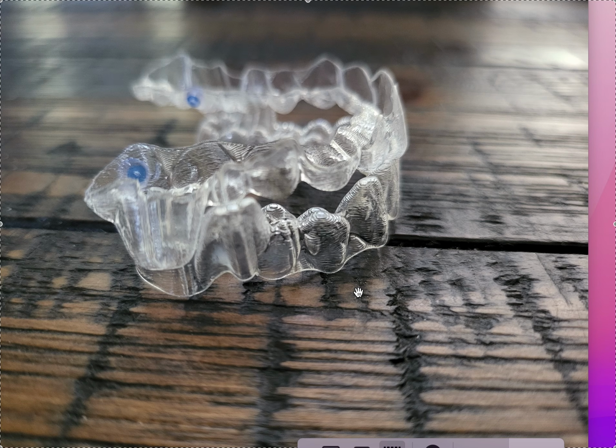And anterior posterior changes mean jaw, your jaw being forward, your jaw being back, your lower jaw, e.g. a class 3 or a class 2 kind of bite. So they're going to ask you, how do you want to fix the anterior posterior discrepancy? What are your options? Elastics, IPR, sequential distalization, or Invisalign with MA is another option, or leave it, right? So those are generally your options.